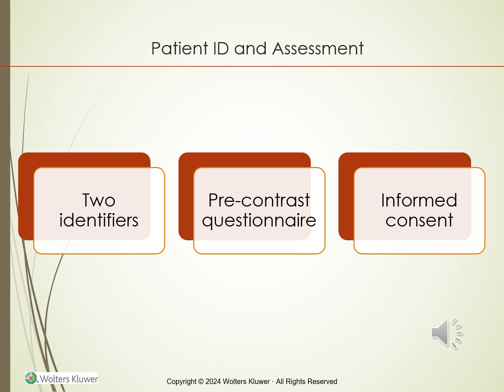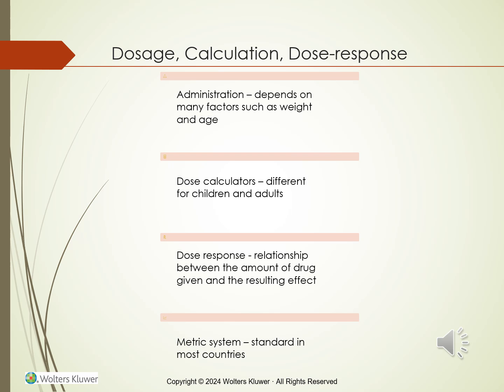Before giving contrast, the radiographer should perform the pre-contrast questionnaire to identify any potential complications. The answers will help the radiographer alert the radiologist of any concerns. Sometimes a test dose of contrast is given to the patient to check for reactions before a full study is done. The amount of drug given depends on how it is administered and the patient's age.